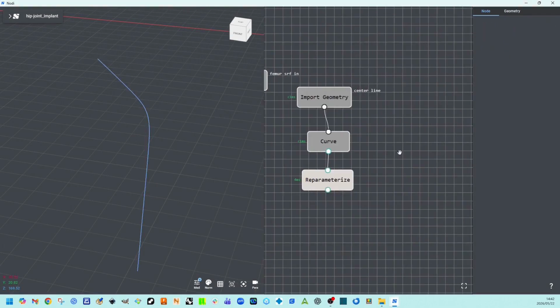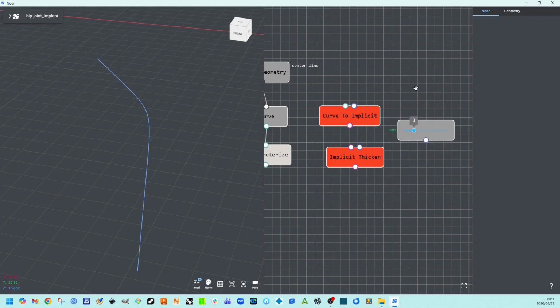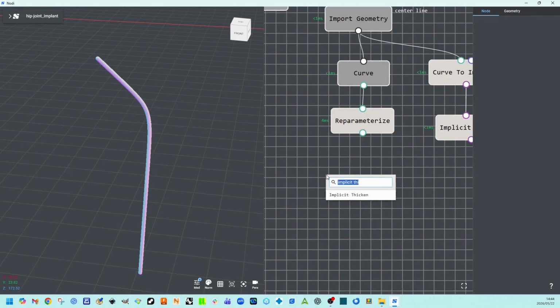To build the inner spine, we import the centerline curve, run it through Curve, and reparameterize. Convert it with Curve To Implicit, and use Implicit Thicken to give it a solid radius.